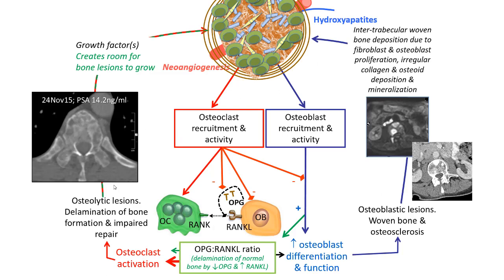So we're back to this picture, and this is the key picture. So if you want to take a second picture, this is the picture to take. Okay, so this is the woven bone with the mineralization. The tumor cells are at the margin. You've got the laminated bone, which is stopping everything growing. The signaling in the center, with these osteoblasts in the middle, is signaling over here. Tumor cells are being displaced to the margins.